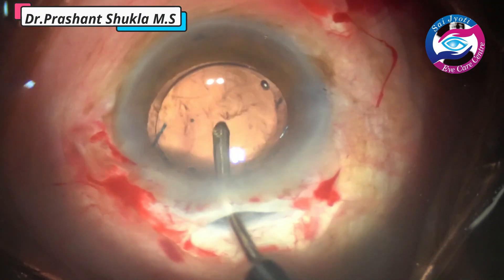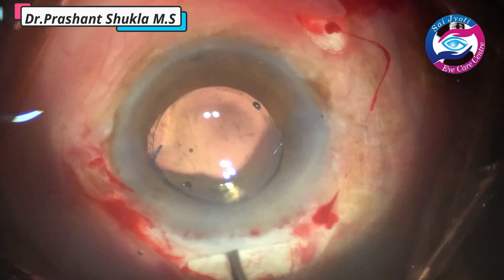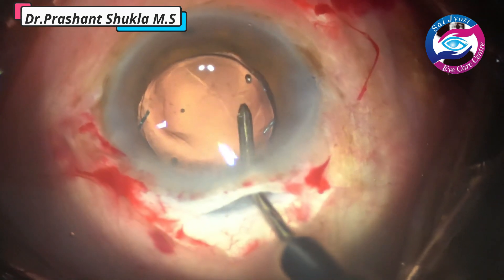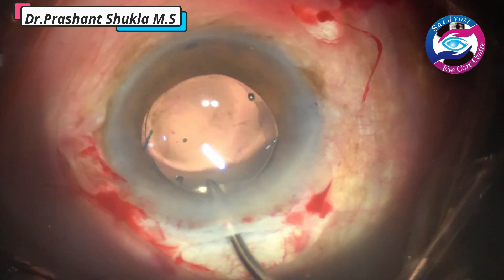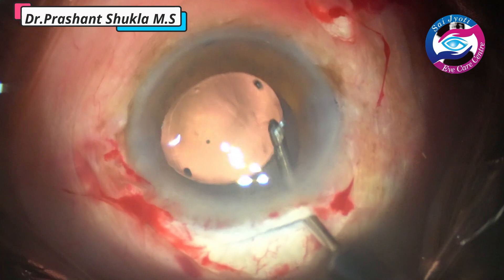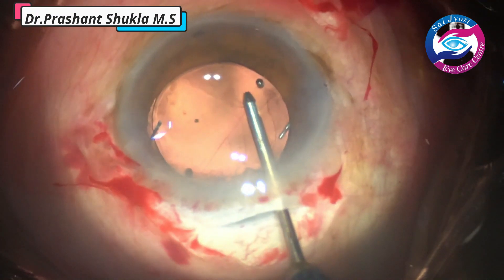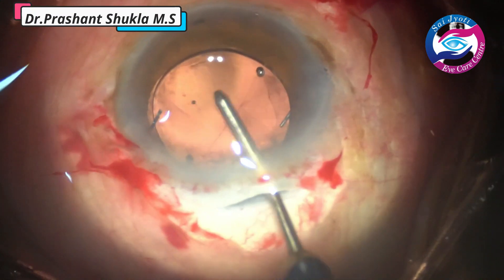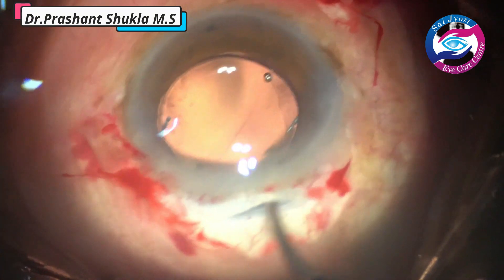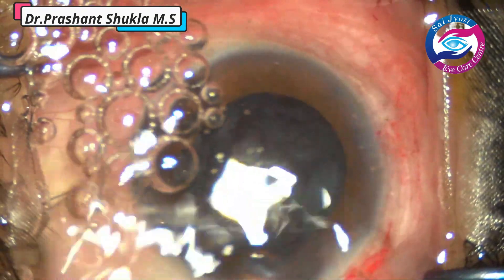The water jet of the irrigation handpiece is used to flush out the viscoelastic from the interior part and behind the intraocular lens. This is a very good tool to flush out whatever debris and cortex is left. There are fewer chances of catching the posterior capsule this way — beginners using irrigation and aspiration together can catch the posterior capsule. It is a good idea to irrigate first, then use both irrigation and aspiration.